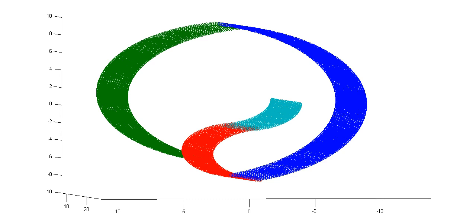An example of this would be, okay, the screen will be black and white, and the screen will flicker from black to white or white to black at some slow rate. And then maybe you would expect some visual area, like much of the visual cortex, would basically have activity that looks like the flickering of that screen.